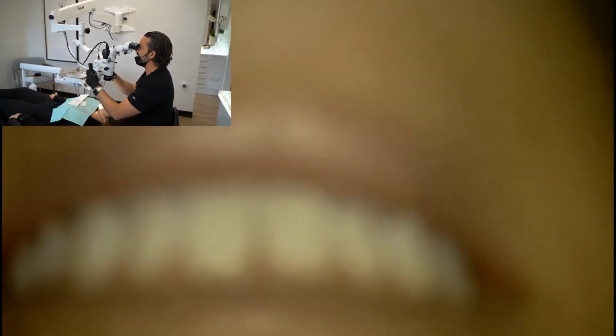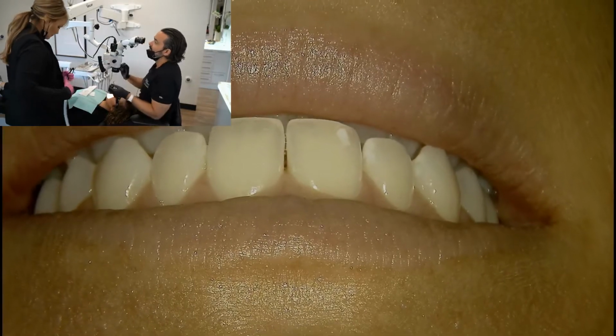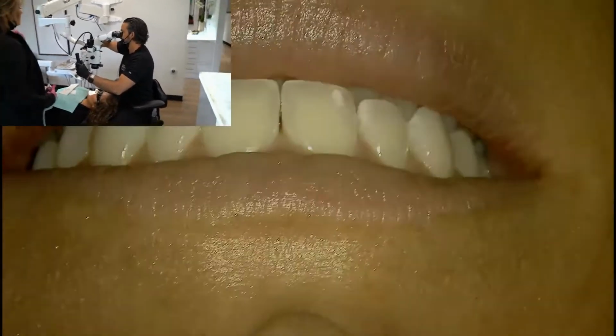Anyways, you can see it. My room is all orange because I'm running around with the filter. All right, so let's just show the light intensities here on her front teeth. Let's get her back in focus. Now, let's go down to the very lowest setting.